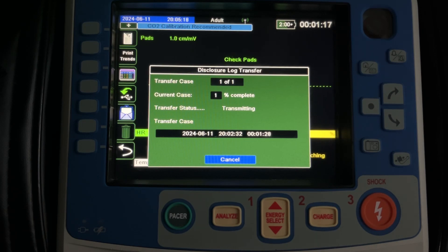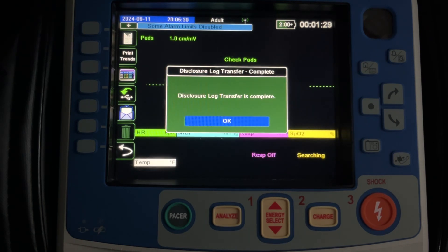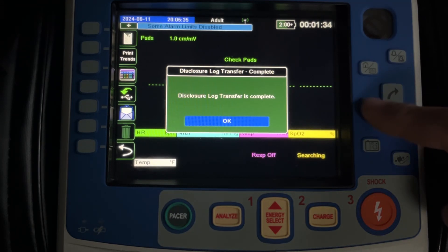You'll see a progress screen come up. The time it takes for the upload to occur will be dictated by how long the call was and how much information was on the call. Once you see the message 'Disclosure Log Transfer Is Complete,' you've now sent it to ImageTrend.